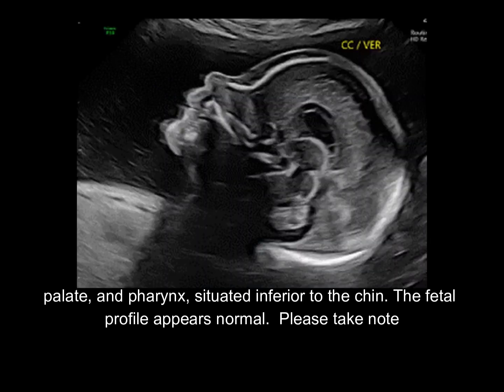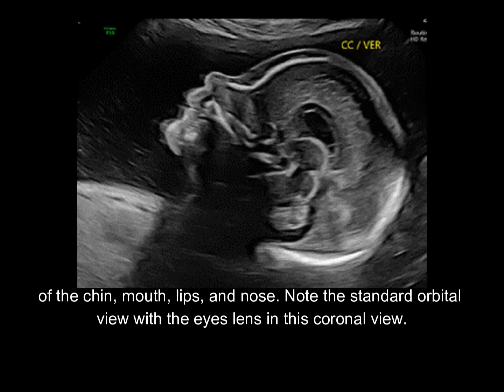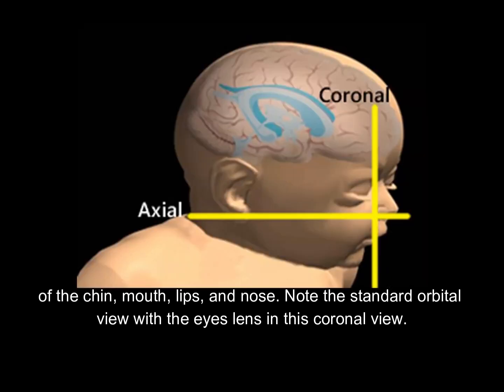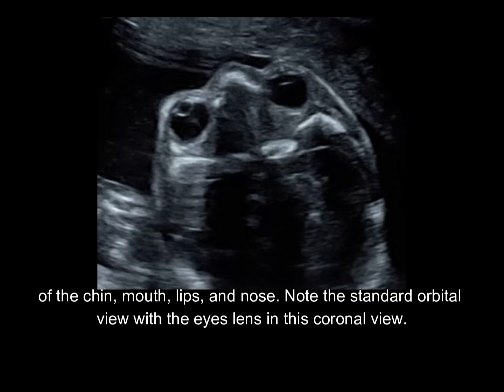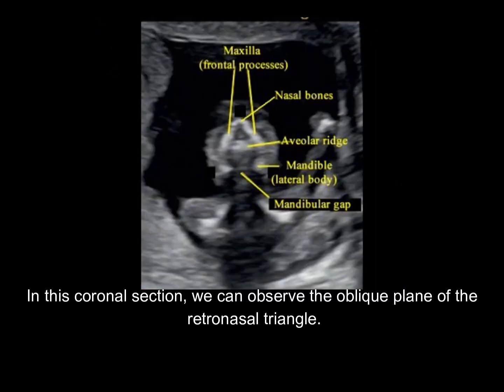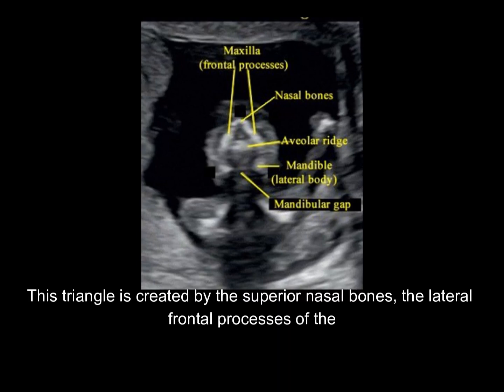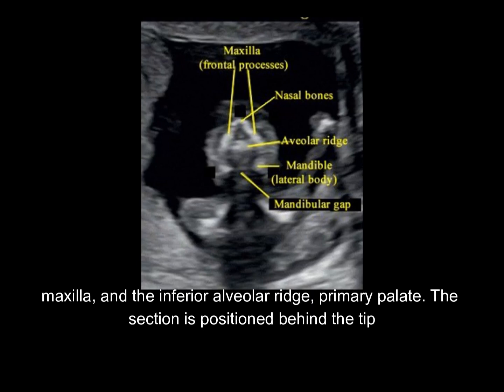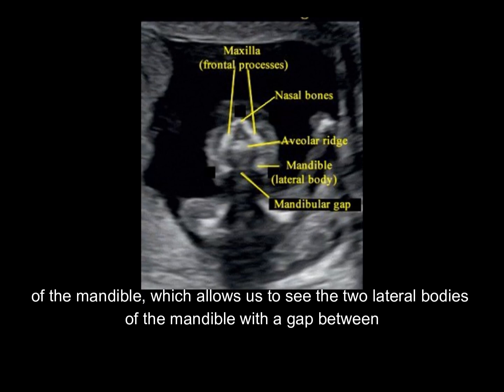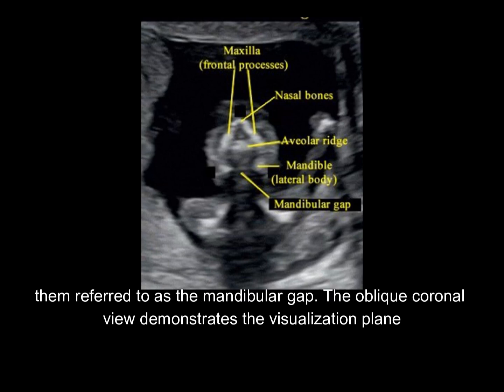The fetal profile appears normal. Please take note of the chin, mouth, lips, and nose. Note the standard orbital view with the eyes and lens in this coronal view. In this coronal section, we can observe the oblique plane of the retronasal triangle. This triangle is created by the superior nasal bones, the lateral frontal processes of the maxilla, and the inferior alveolar ridge or primary palate. The section is positioned behind the tip of the mandible, which allows us to see the two lateral bodies of the mandible with a gap between them, referred to as the mandibular gap.